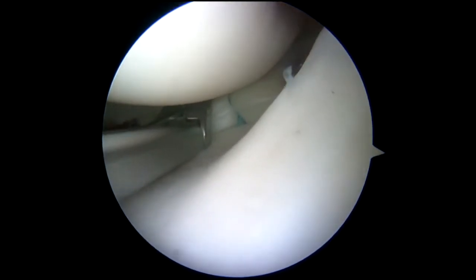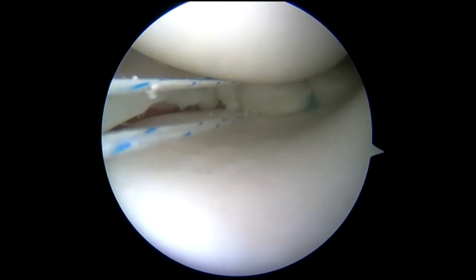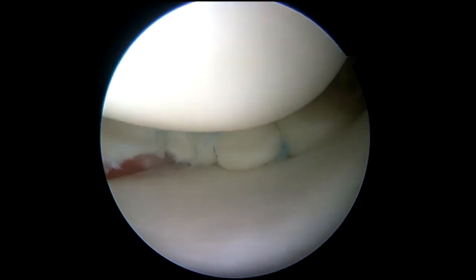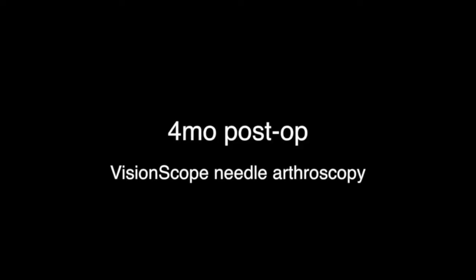Because it doesn't have an apex anymore, I went ahead and did hay bale stitches, which are sutures placed behind the meniscus remnant and then tied in the front. I relied on the fact that he's 19 to remodel this meniscus into a functional shape, and in the absence of arthritic change, there are enough nutrients in the synovial fluid to allow this meniscus to not just heal, but also to be remolded by the femur and the tibia.